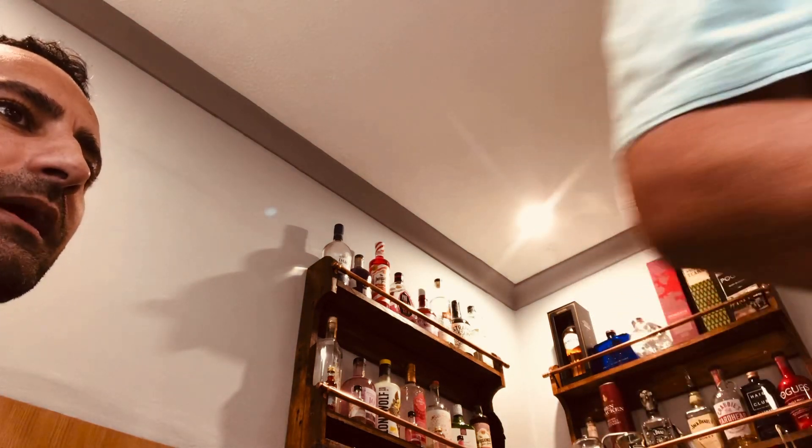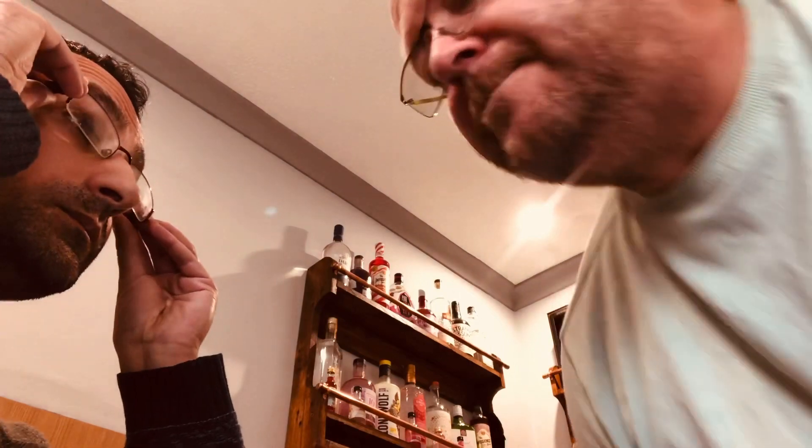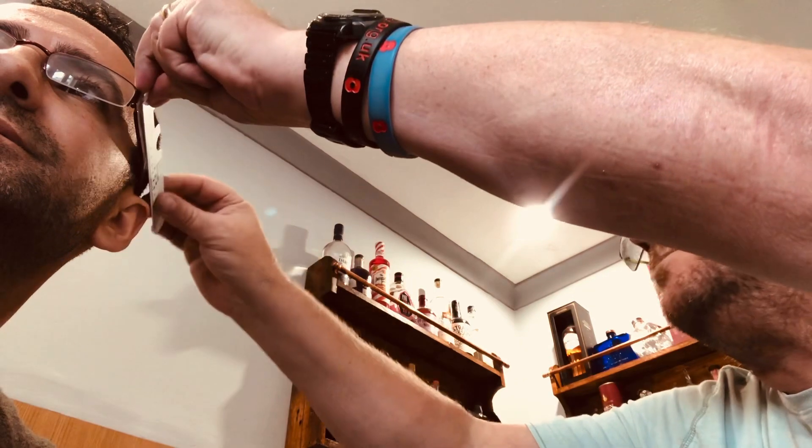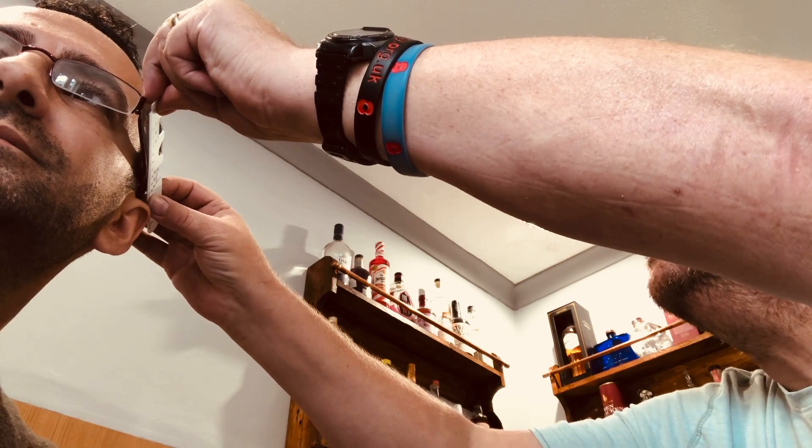I also want to measure the distance, so I'm going to pick up a pair of spectacles for you to put on, and I'm going to measure the distance of the length of the side to the back of your ear. This measurement is called the length to bend. I'm measuring not from the front of the frame, but to the end of the side, and your length to bend is 103 millimeters.